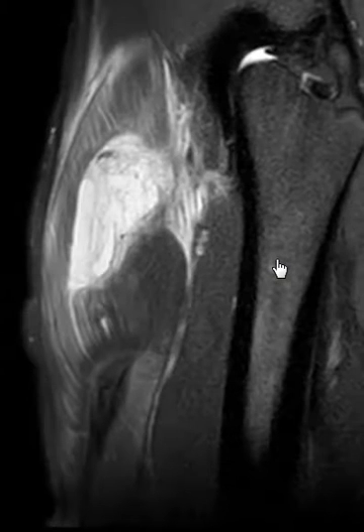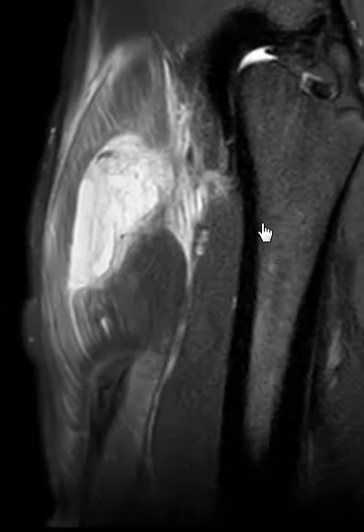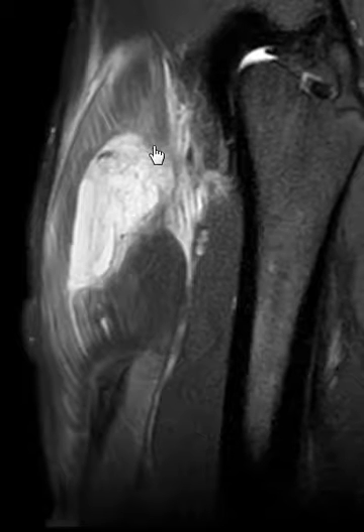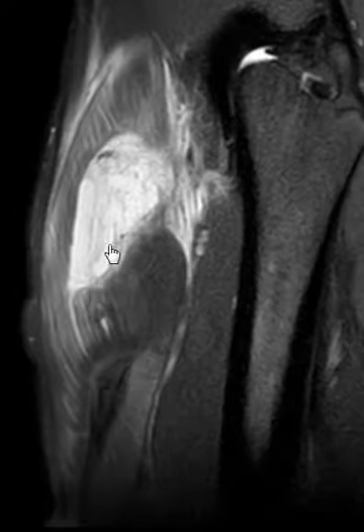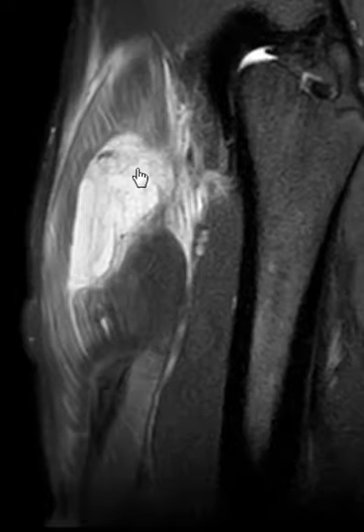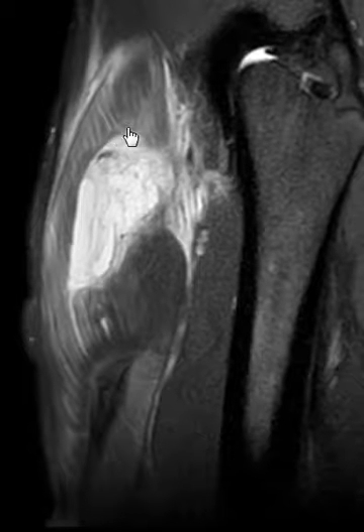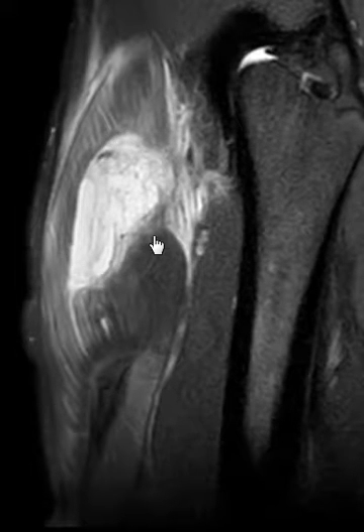You can see an unusually well-defined tear of the proximal rectus femoris, and it's a pretty big tear too. These are not uncommon, but it is uncommon to see them so sharply defined like this. This part of the muscle should sit right up here, but it's retracted back — a very sharply defined tear.